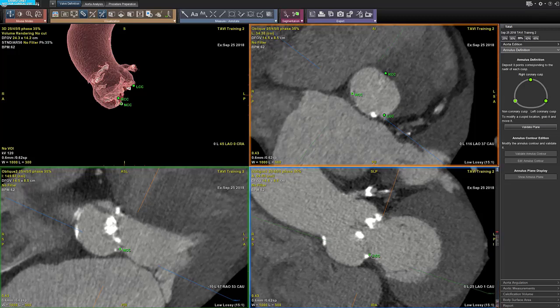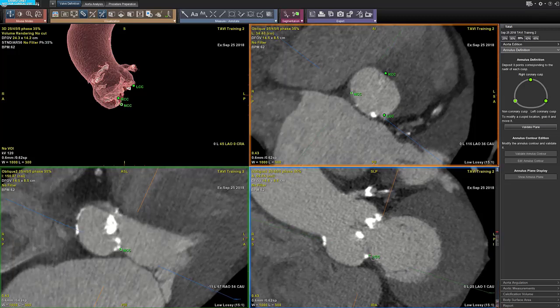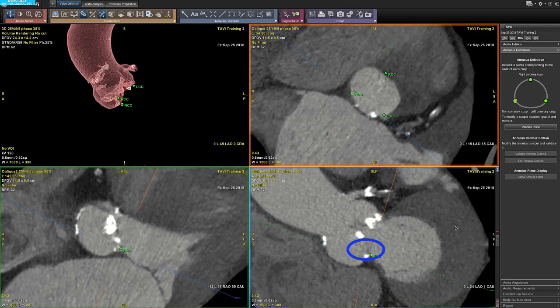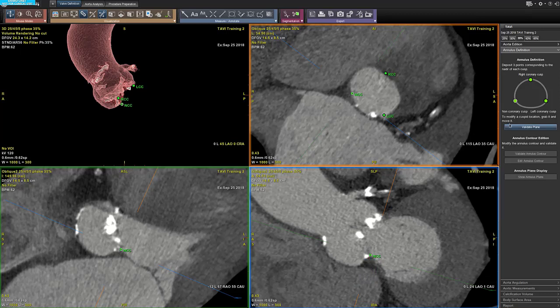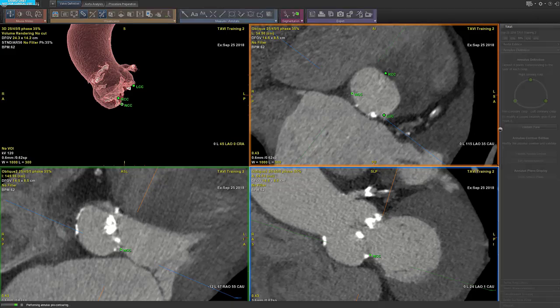You can edit the position of any of those points as needed. To do so, you grab and move the point. You can also delete the point by right clicking on it and selecting delete. Once you have defined your annulus plane, you can validate it by clicking on the validate plane button on the wizard panel.